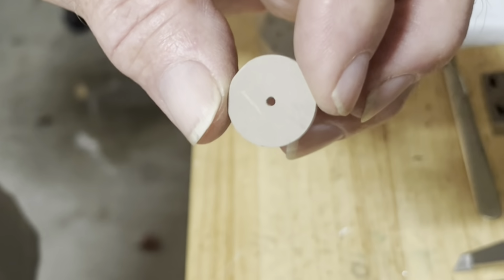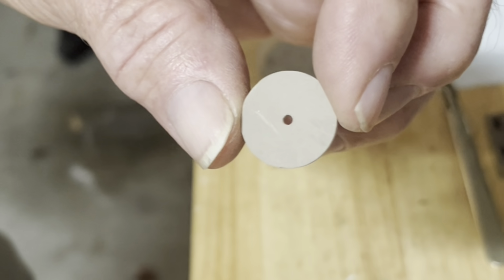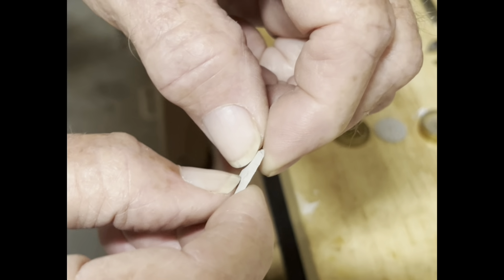And anyway, the long story short, I actually got a pre-fired ceramic, because Telectronics made their own ceramic components to do with pacemakers, feed-throughs and connections, and so I got the guys in the other factory that did those to extrude me a 25mm diameter length, about 300mm long, of ceramic, but I wanted it not in mud form, I wanted it pre-fired, which made it workable. So with the aid of some of the machinery I had in my area, I ground this with a grinding attachment to a diameter. Now ceramic shrinks 17%, so this had to be 17% bigger than the finished diameter.